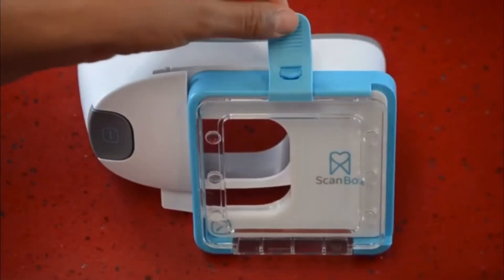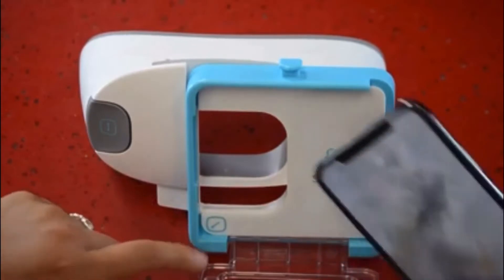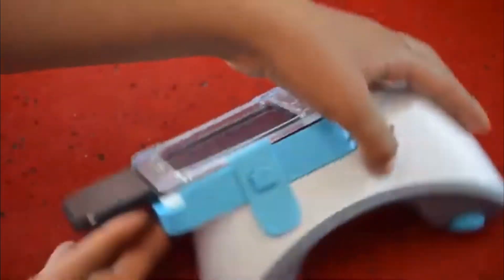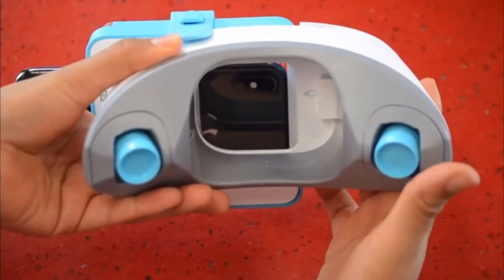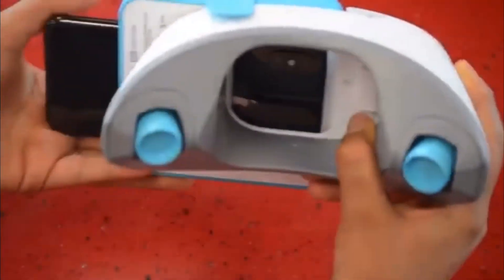First, place your phone into the scan box. Make sure the top left corner of your phone matches the arrow at the bottom. Close the lid on your scan box. On the back, make sure that the teardrop aligns with the top of your camera. If you need to adjust this, you can use the gray button to make sure that it's just perfect.